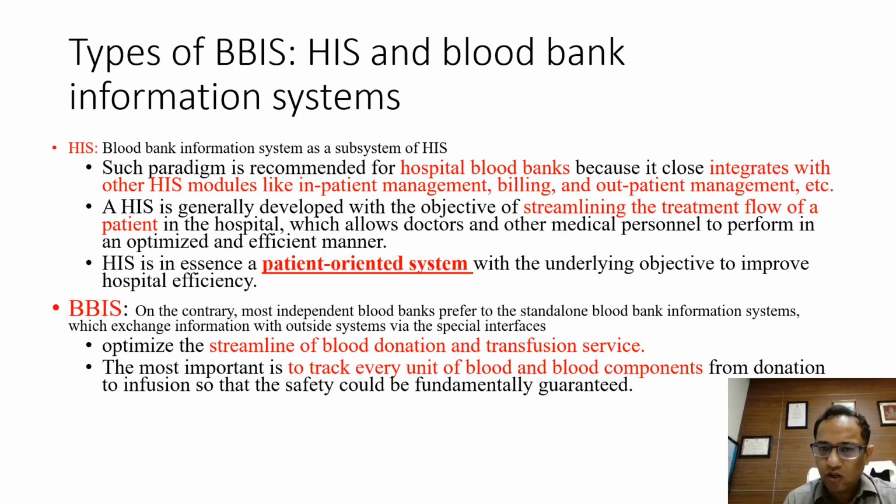This is generally developed with the objective of streamlining the treatment flow of a patient. So it is a very patient-oriented system, and it improves hospital efficiency. Of course, a blood bank information system is more appropriate for a standalone blood bank, but it is also now widely accepted with hospital blood banks. It optimizes the streamlining of blood donation and transfusion services, but most importantly, it tracks every unit of blood and blood component from donation to infusion so that safety can be fundamentally guaranteed.